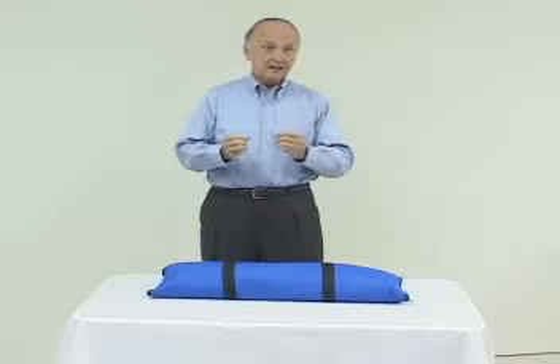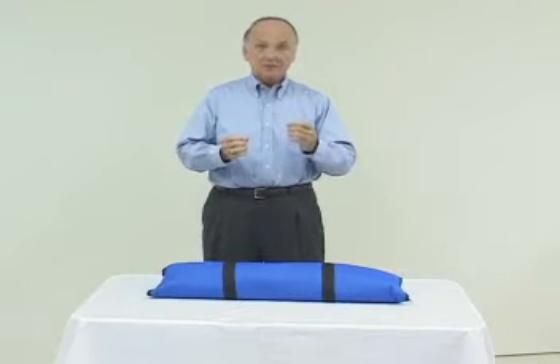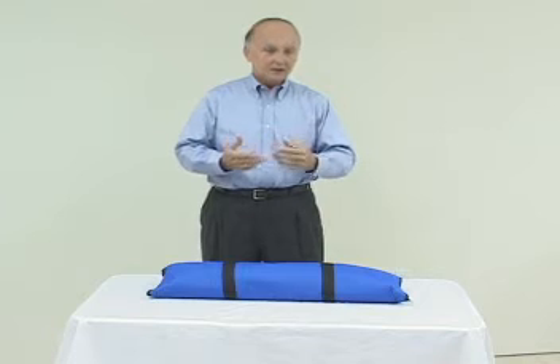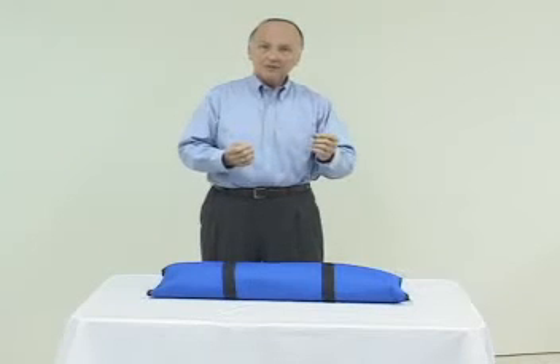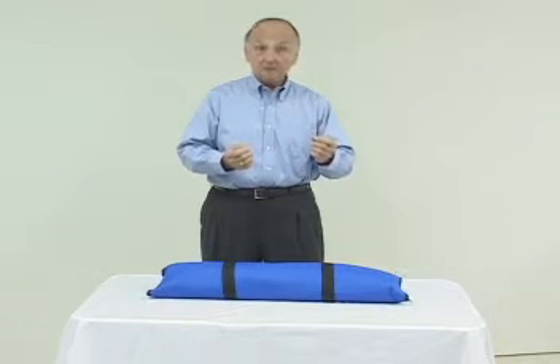What we're going to show you today is our basic multi-purpose IV arm — IV, IM, sub-Q — and show you some of the features about that. And most importantly, we will show you how to remove the skin and the veins and repair the arm in the field.